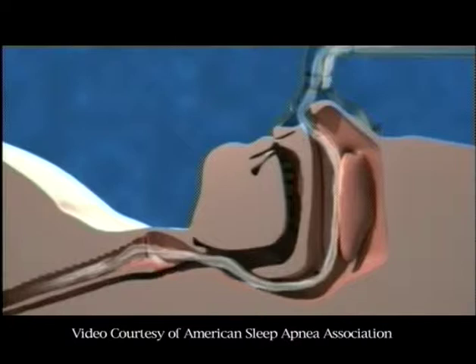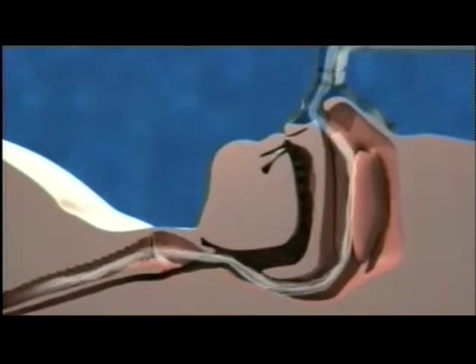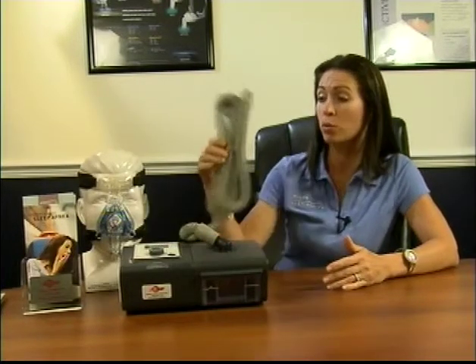Faces to your face, but just a pressure seal with a hose that generates a column of air pressure that just holds that airway open. And it sounds primitive, but it's amazingly effective. It is room air that's basically taken out of the room and through the filter in the back of the device and put through a motor, and it's delivered through the tubing and then ultimately through the mask.